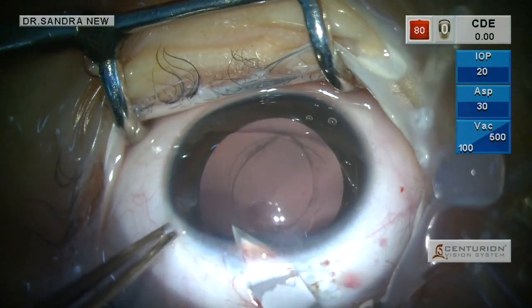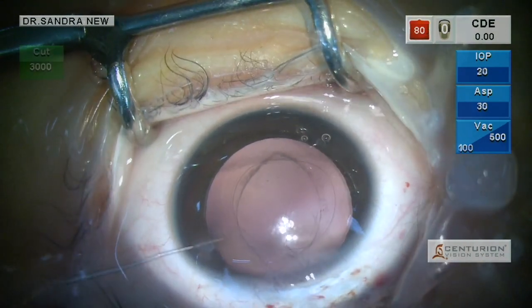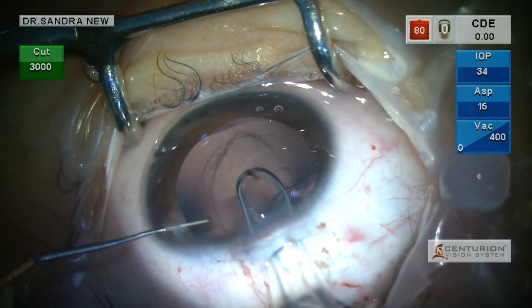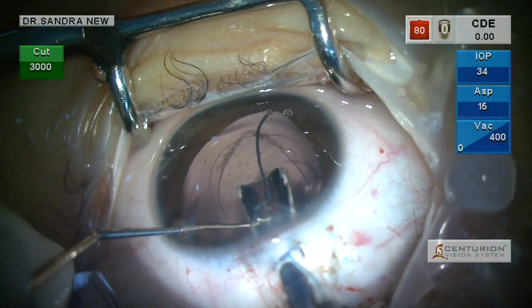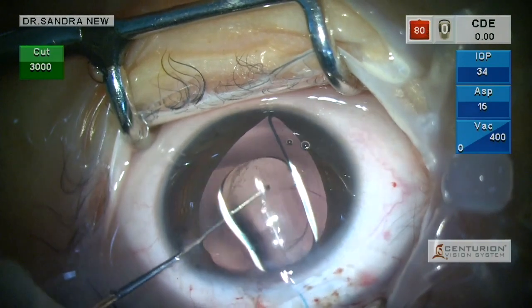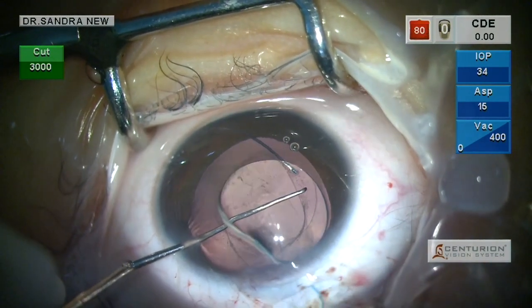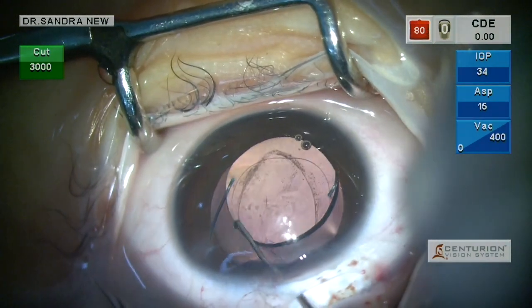The anterior and posterior capsular margins are now very clearly seen. I am extending the incision slightly, which will enable me to inject the three-piece foldable acrylic lens into the eye. The plan is to inject the three-piece lens into the sulcus. I am not planning to inject this lens in the bag owing to the presence of a large posterior capsular defect, which may cause decentration or subluxation. My aim is to inject it fully into the sulcus initially and then do an optic capture of the optic under the anterior capsule.